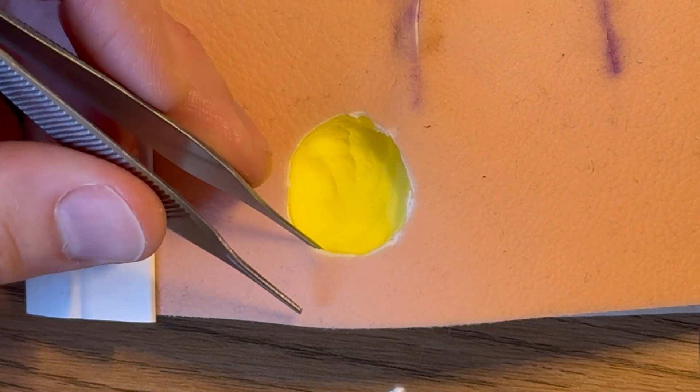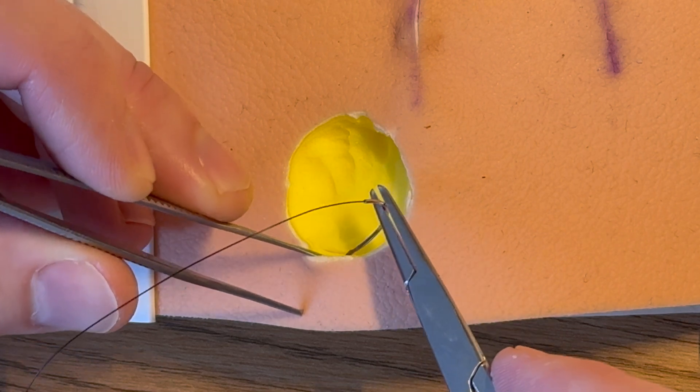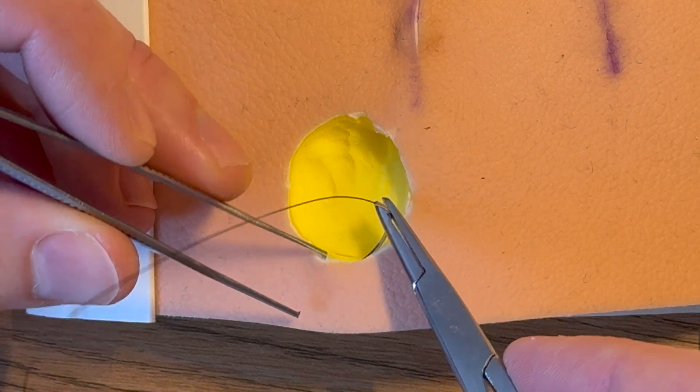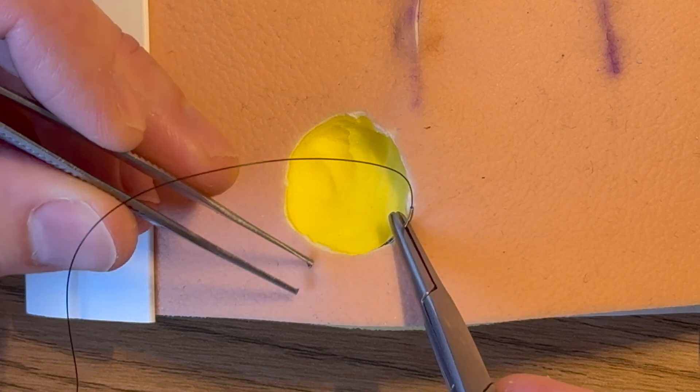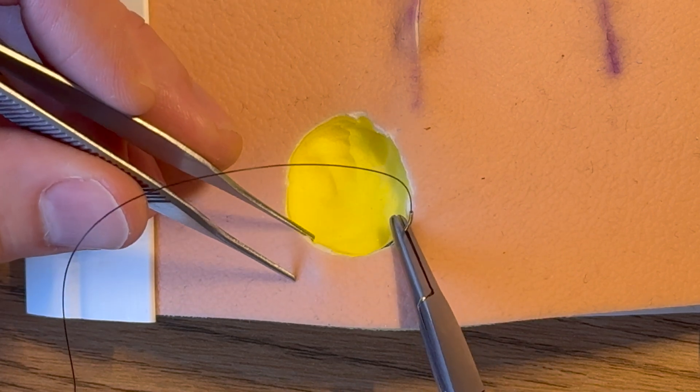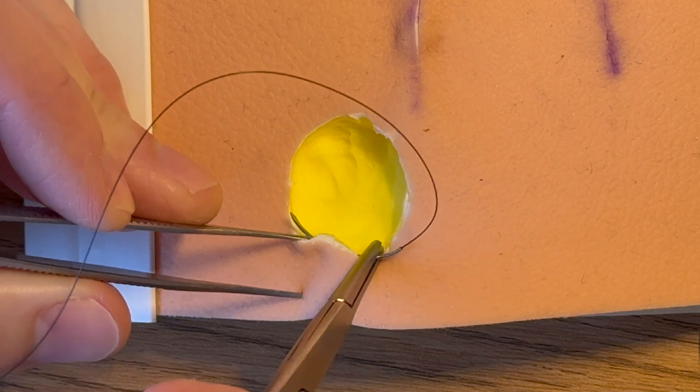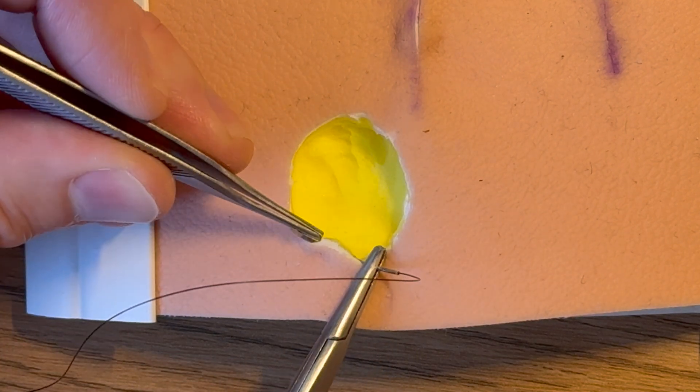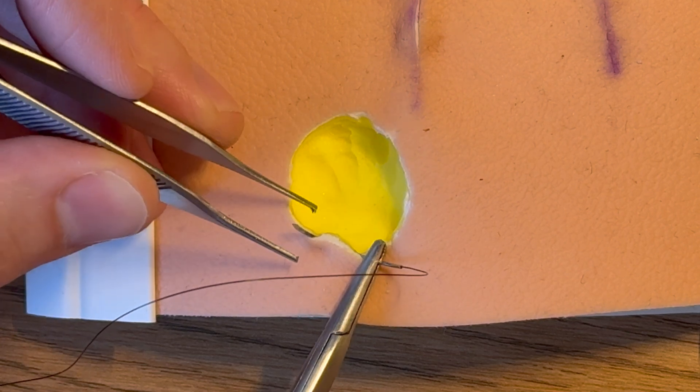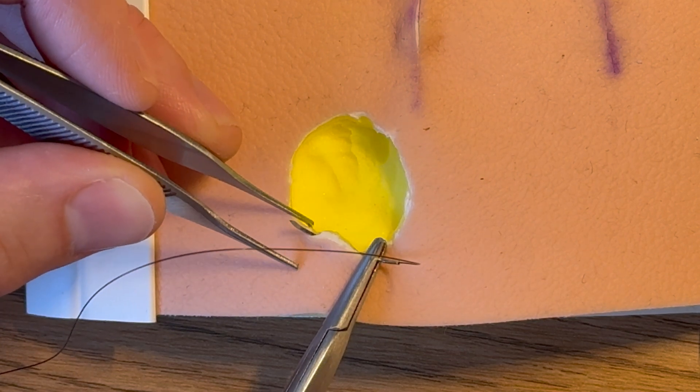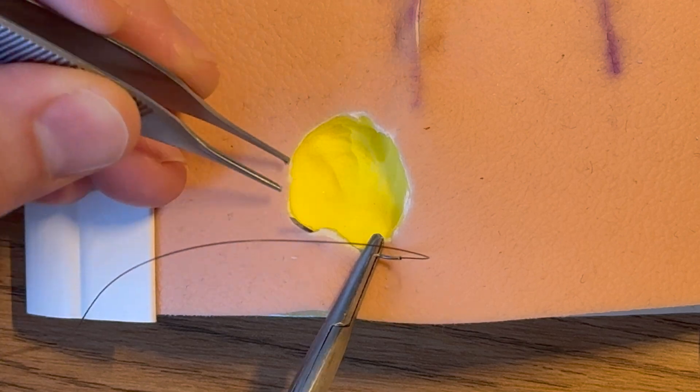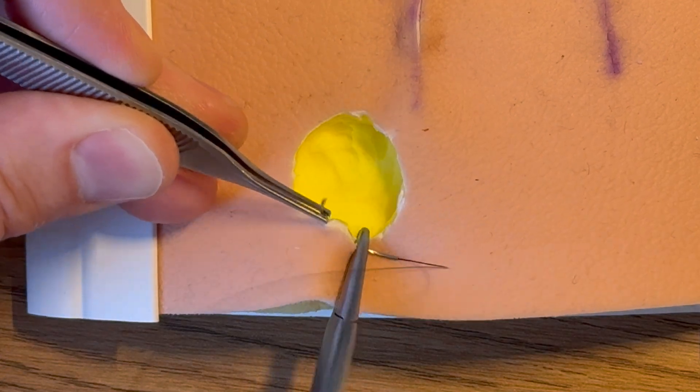So if we just pick up the edge of the skin a little bit and just grab a bit of dermis as we would with our normal buried stitch, come through, and you want to take only about a third of the needle curvature. Don't push it too much otherwise it will bend and you'll struggle to get it through in position.